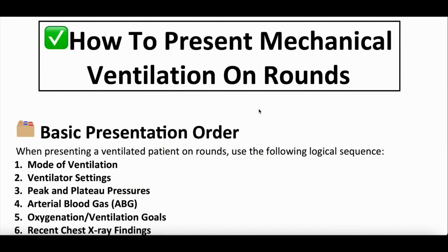Today, we are going to be talking about how to present a patient on mechanical ventilation on rounds at the hospital. This will be interesting for anyone who works in the clinical arena, whether you be a student, trainee, or anyone who is presenting on rounds, thinking about how to present on rounds, or wants to figure out how to teach how to present on rounds. In addition, it could be interesting to the general public too, for those interested in loved ones who unfortunately found themselves on mechanical ventilation and some of the things we think about. So the goal here is to show everybody how to thrive, how to impress on ICU rounds.